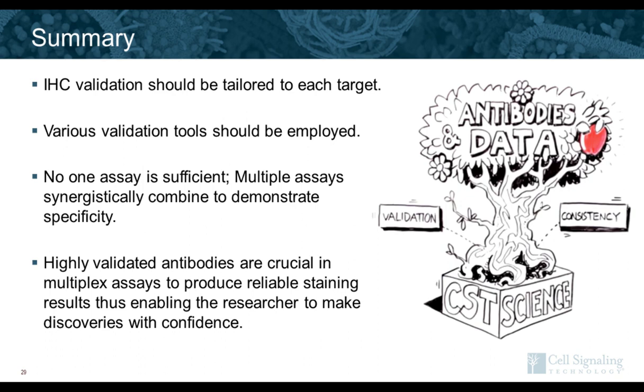Yeah, so the answer is yes, it can be visualized on a standard confocal microscope or even your standard fluorescent microscope. As long as you have the correct laser lines or filter sets in place, you'll be able to use OPAL. The Vectra and Mantra are nice to have because if you want to move beyond those 3 or 4 colors where you're getting spectral overlap, then if you want to get to those 7 or 8 colors, you most likely would need a multispectral instrument like the Vectra or Mantra.